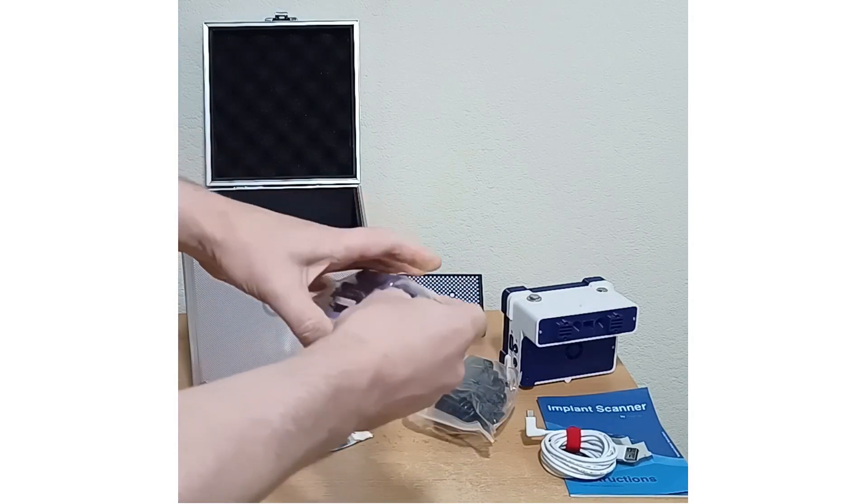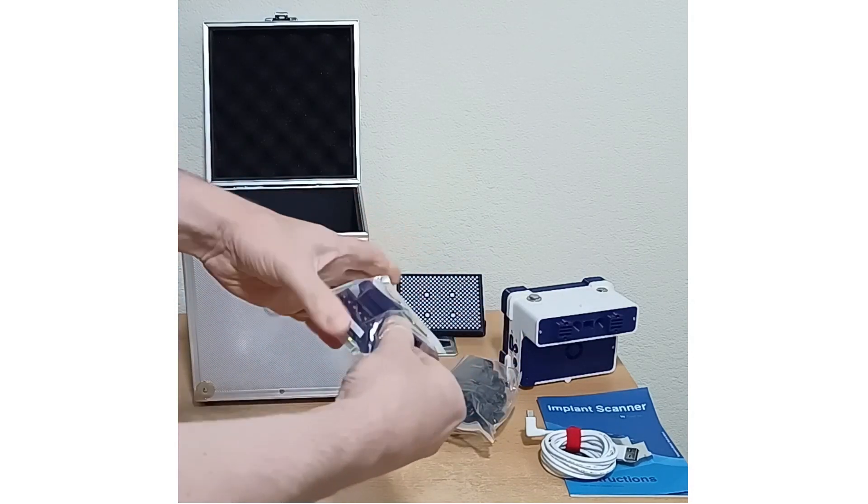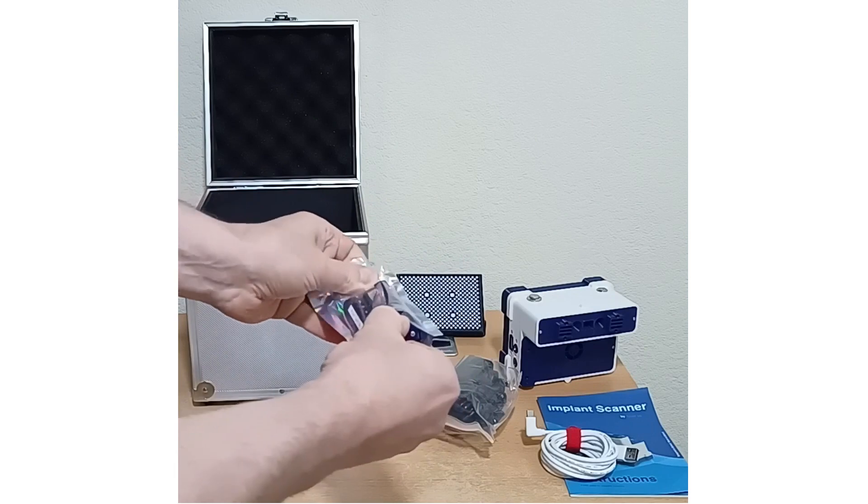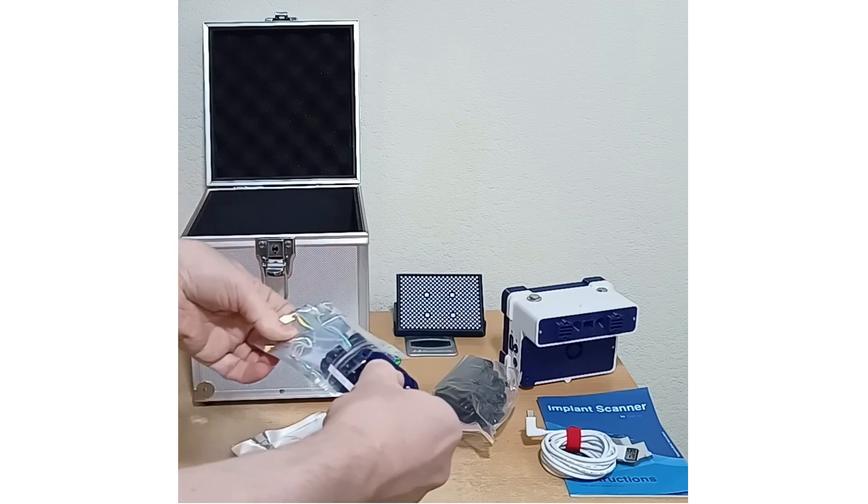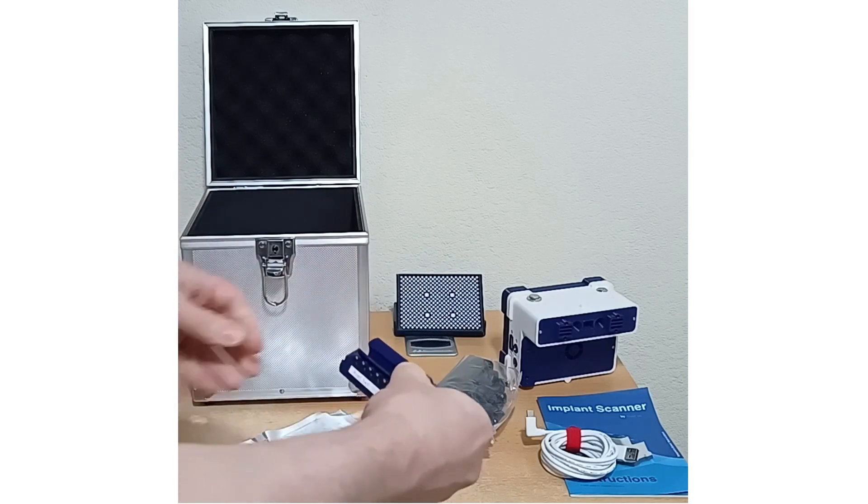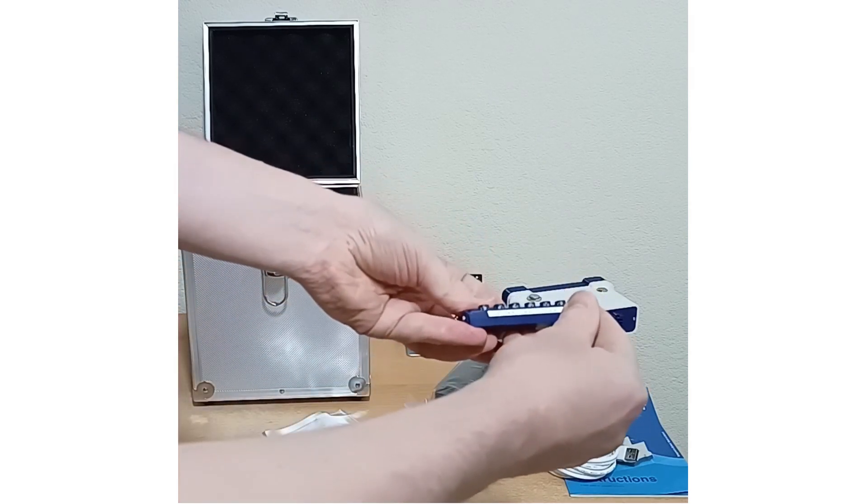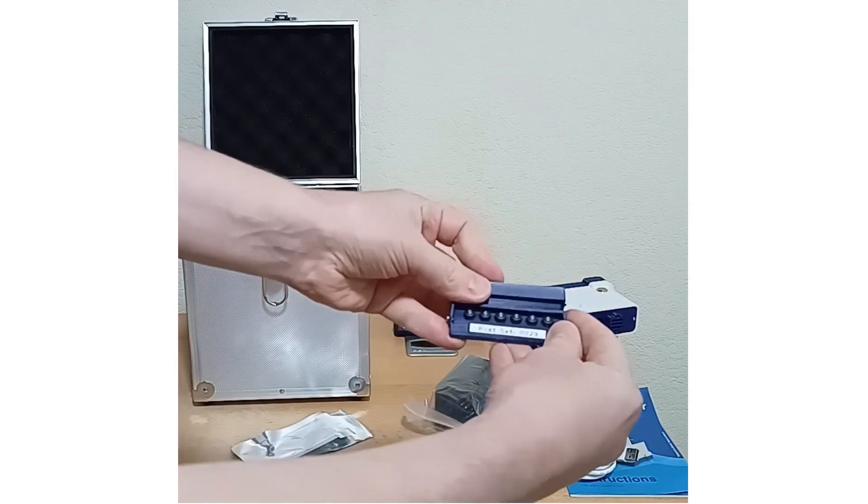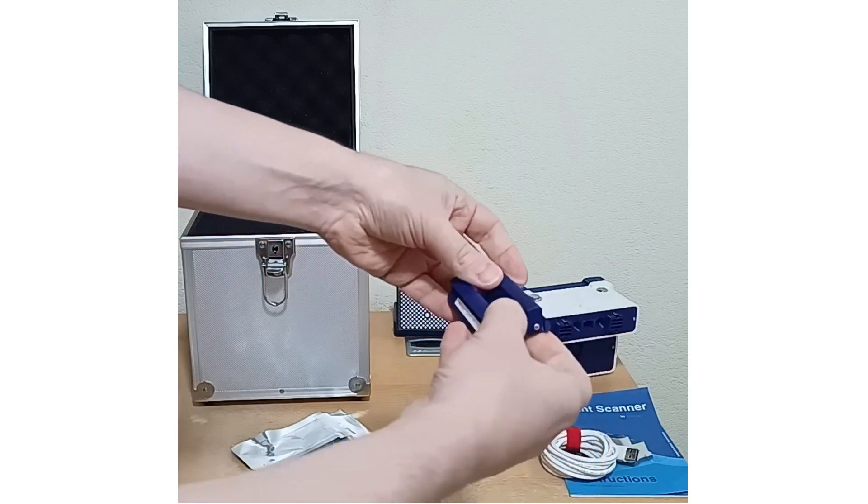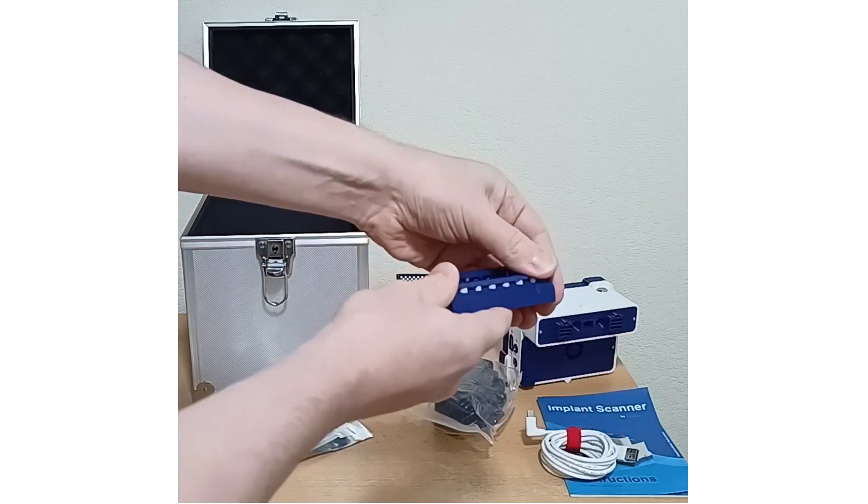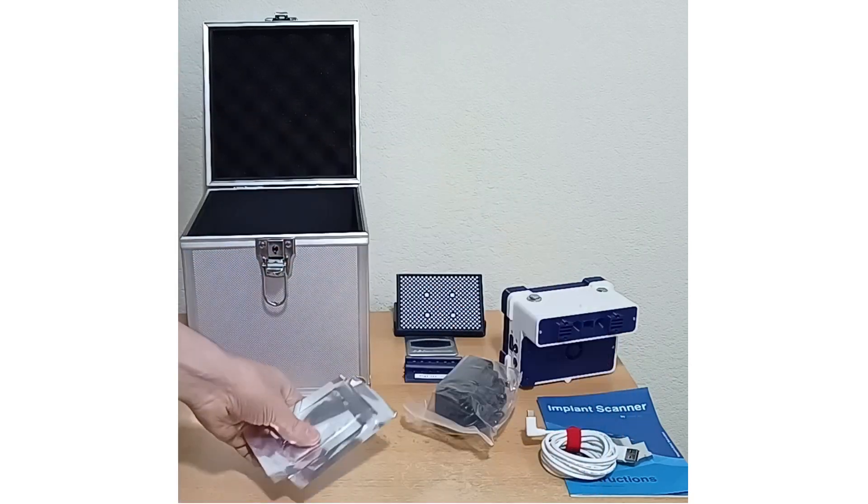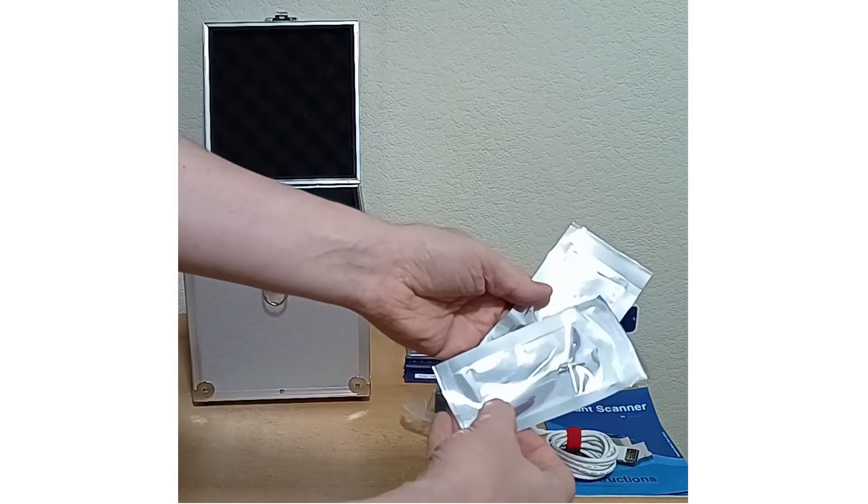You get a set of posts and a set of scan bodies, six of each, and the standard tools for screwing them in.